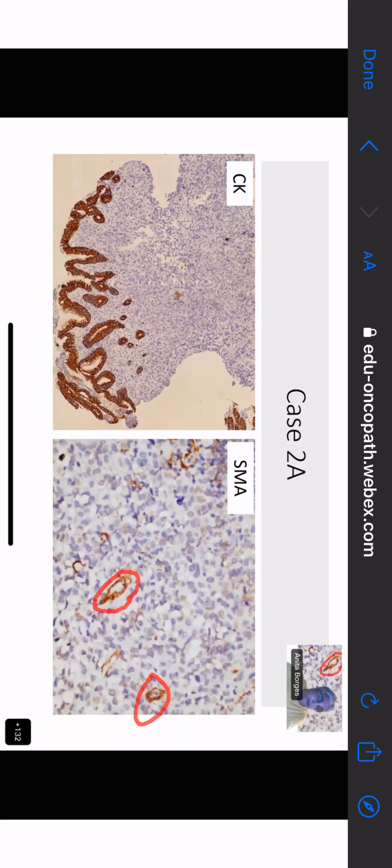What do you think, Suvaita? Yes, ma'am. Tumor cell. Where is the nucleus of that tumor cell? Can you show me? Mark the nucleus of that tumor cell. Ma'am, right in the center. You don't think that this is a vessel in which you've got something that's there? You've got a ring, you know? Yes, ma'am. So what do you want to say? Is that positive or negative? Negative. Ah, okay. So once again, it's not about doing the stain, it's about interpreting it.